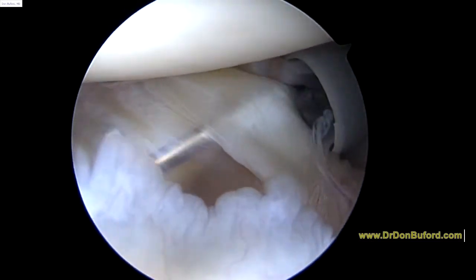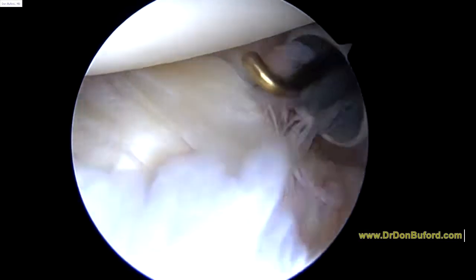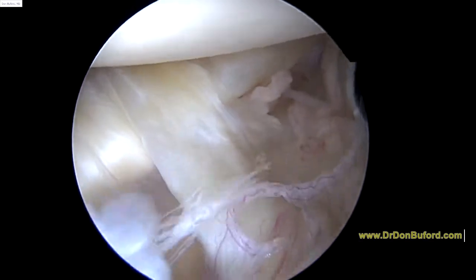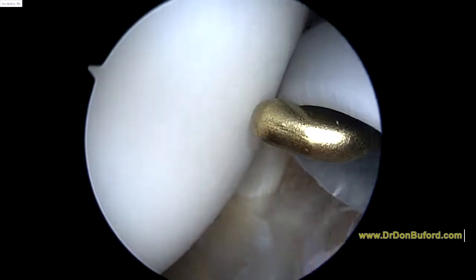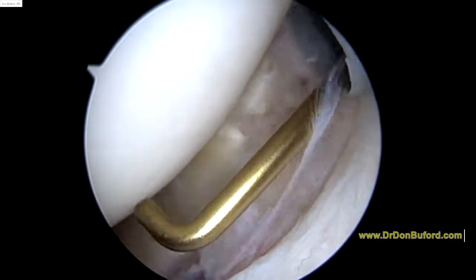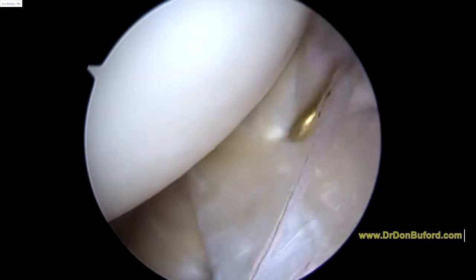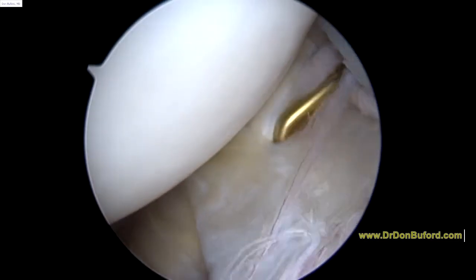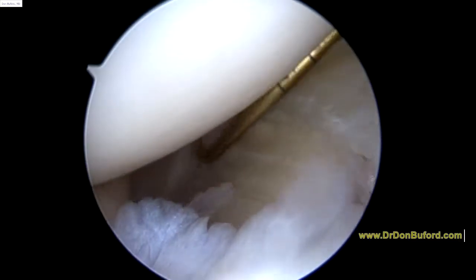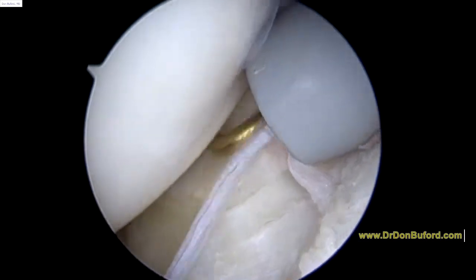See how my probe's underneath? So the subscap is going to be this structure that I'm touching with the probe, all back here. It runs at an angle from about 7 o'clock on the screen up towards about 1 o'clock. And as you rotate and look down this way, we'll get another look at it. This is the subscap tendon right here. That's the superior edge of the subscap. That's the very top of the subscap. Okay? And then of course it travels down in this direction here outside the capsule. About the superior 1/3 is intra-articular though, as you see.